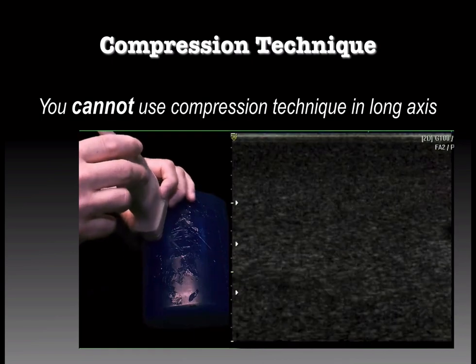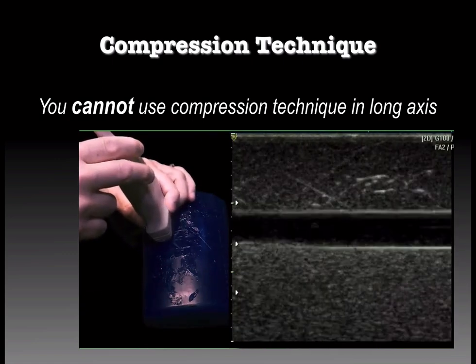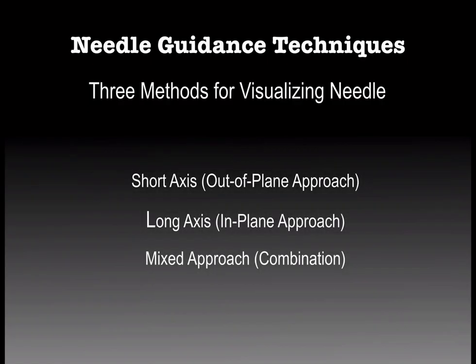Now, the compression technique. One caveat here. You cannot do compression in long axis. In long axis, where it looks like two parallel lines, you don't know if you're compressing the vein and it's disappearing, or you're sliding off to the side. So we only do compression in cross-section or short axis. We're going to talk about three methods of visualizing the needle. Short axis or cross-section is the easiest to learn and conceptually the easiest to master. However, we are also going to show you long axis or longitudinal, so that we can show you the best practice, which is a mixed approach.